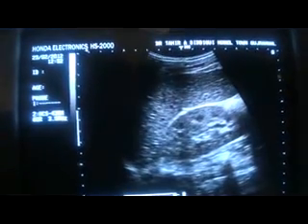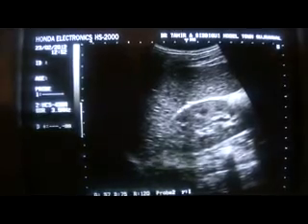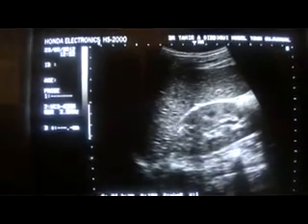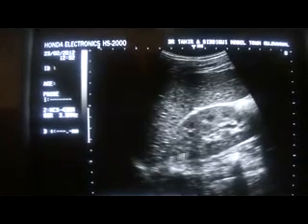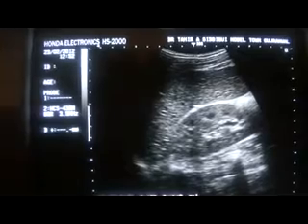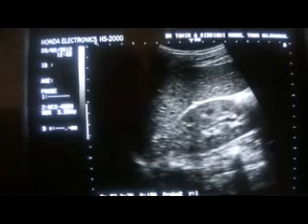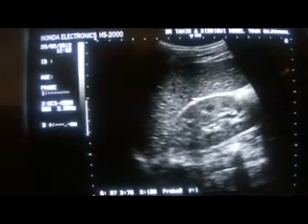This video is to make you understand the renal pyramids, so concentrate on the renal pyramids and forget about the others. I will give you a little overview of the kidney. This is the capsule, this is the upper pole, this is the lower pole, and the echogenic band-like area below the capsule of the kidney is the cortex. The echogenicity of the cortex is almost equal to that of the liver.